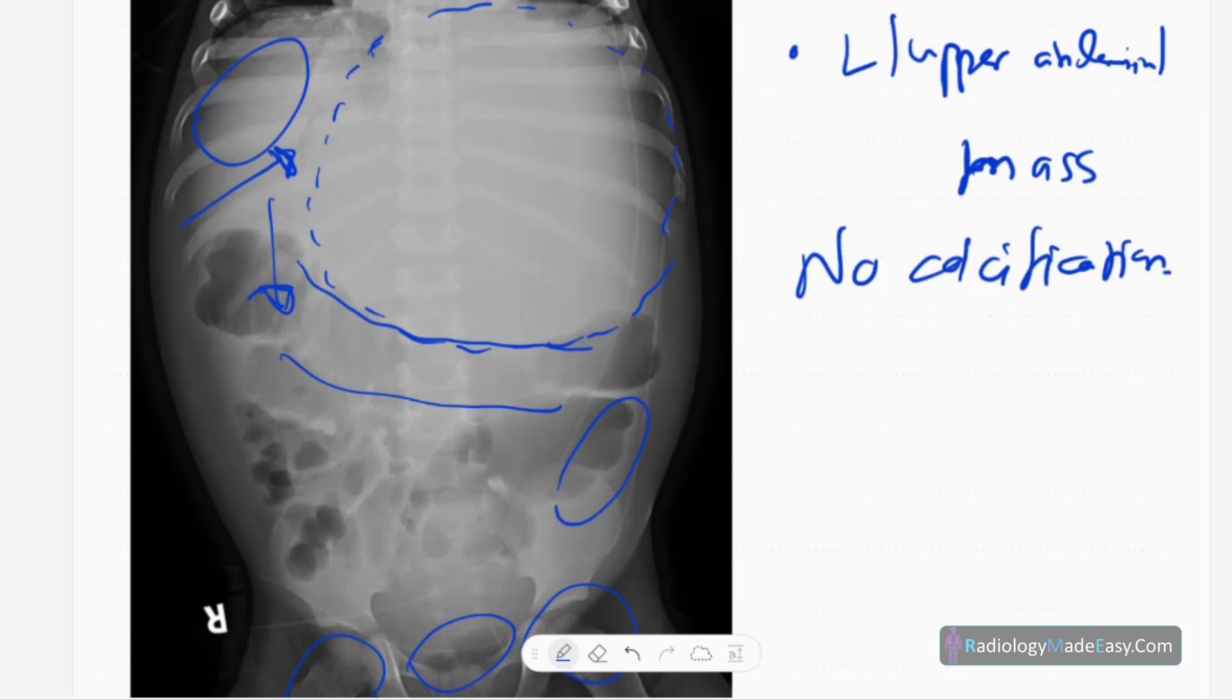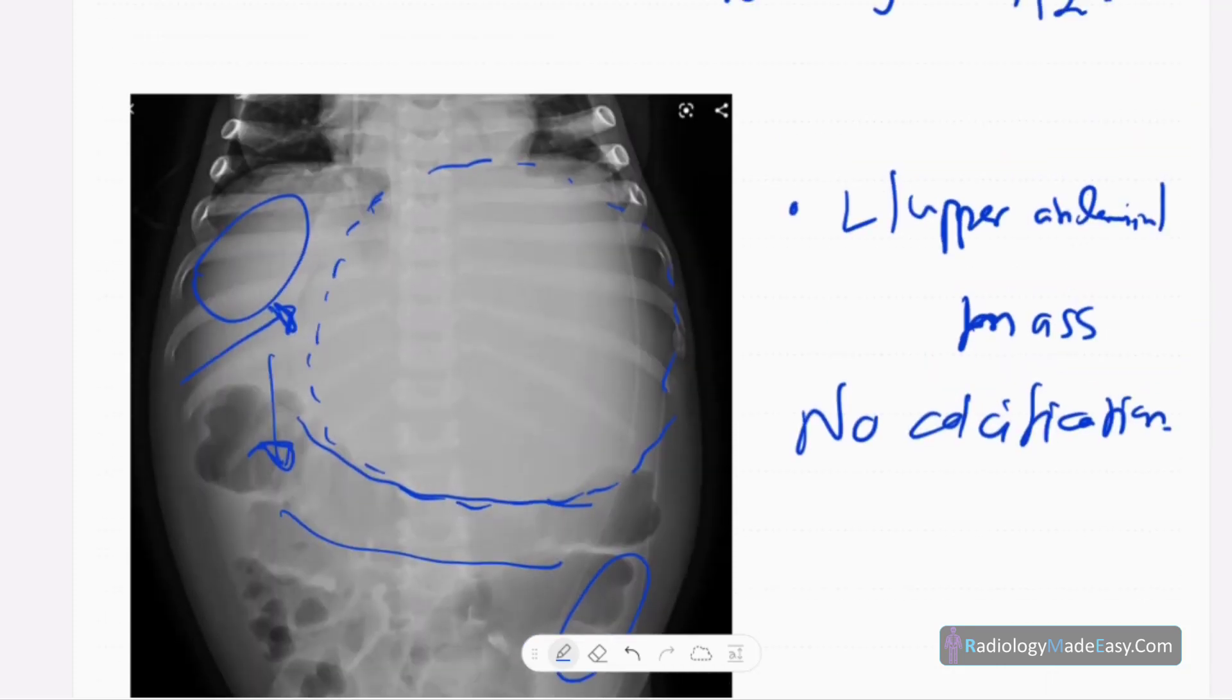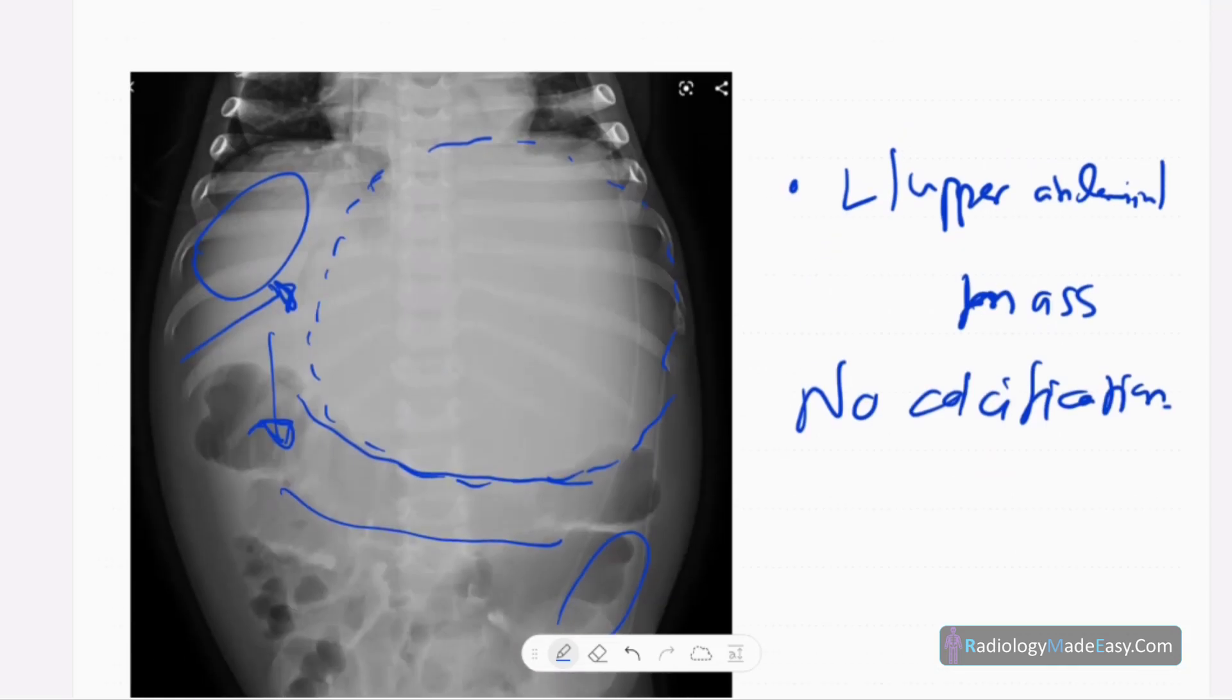So you have to look for the calcifications. Usually neuroblastoma, you can see 30 percent calcification in x-ray, but once you do CT, there's about 80 to 90 percent calcifications. And Wilms tumor, there's about 10 percent calcifications.